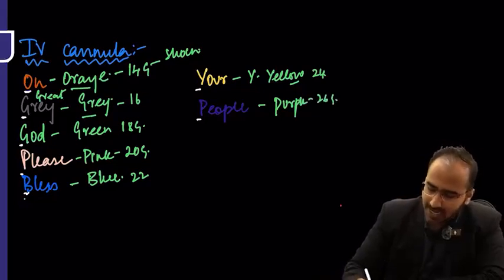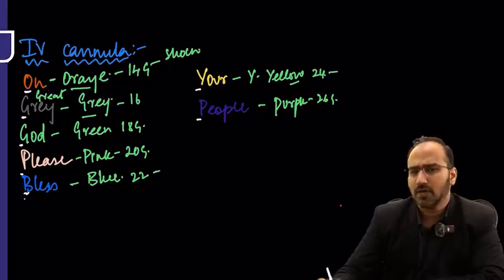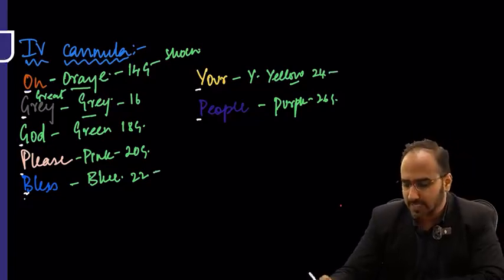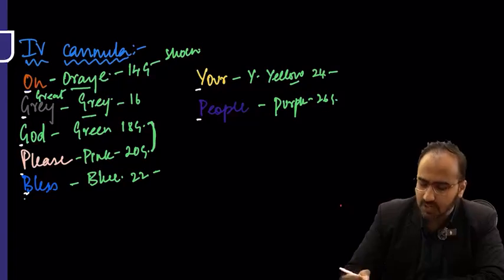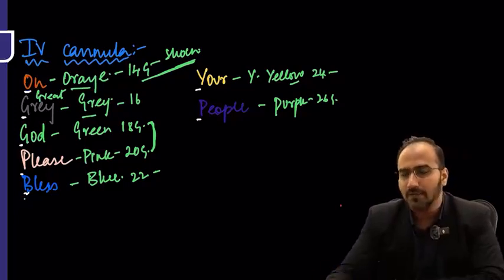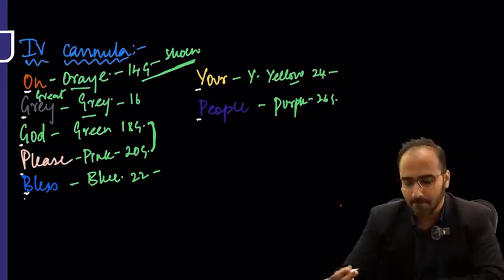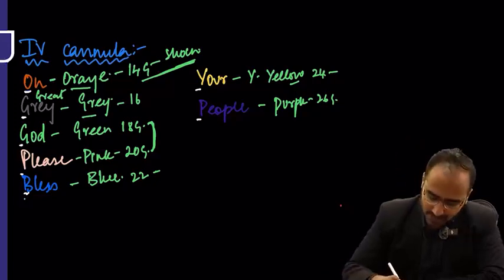Okay? In pediatric cases, we are commonly using 22 and 24. 26 is not used nowadays. Whereas in general anesthesia or any anesthesia cases, 18 and 20 gauge are commonly used. Whereas for management of shock-like conditions, where you have to give good amount of IV fluid to the patient, you go for a 14 gauge IV cannula. This is regarding the IV cannulas.